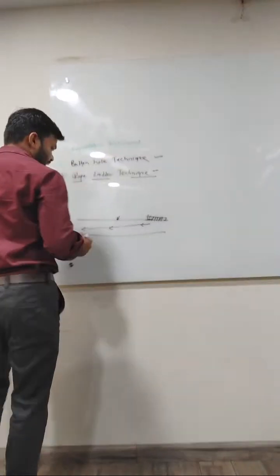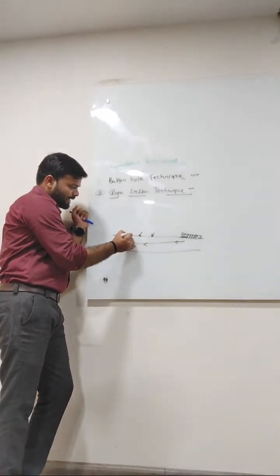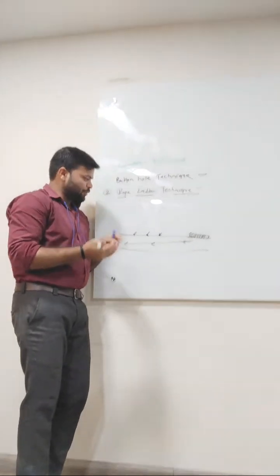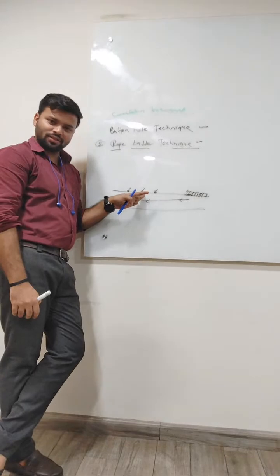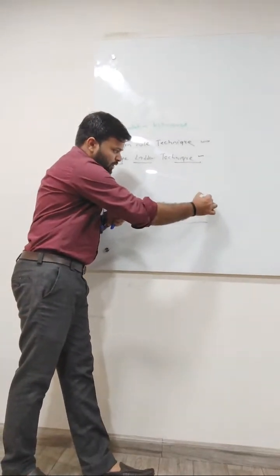then again we will use the second point here, again in the second point here. In this scenario, the patient can feel pain during the cannulation, but it is also helpful to increase the lifespan of the patient's fistula.